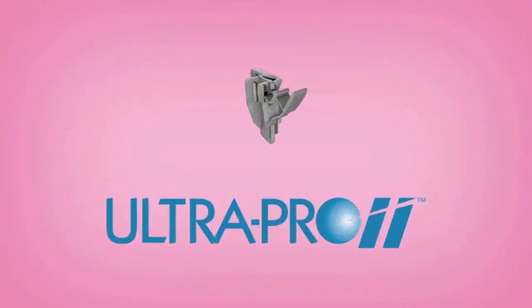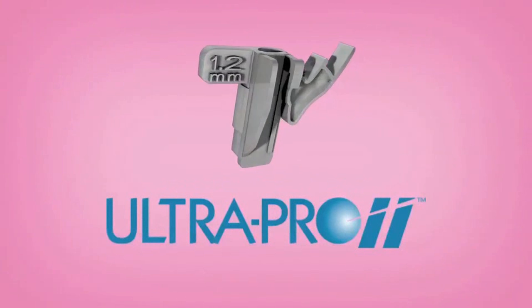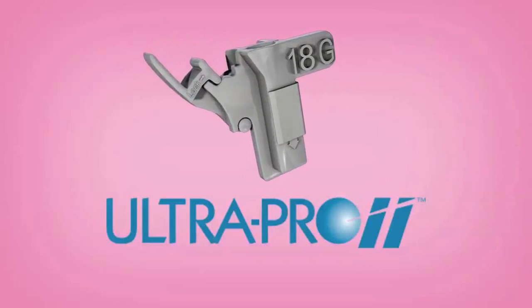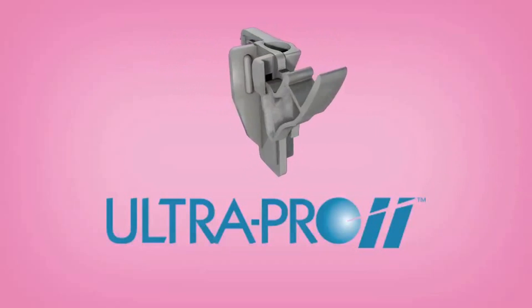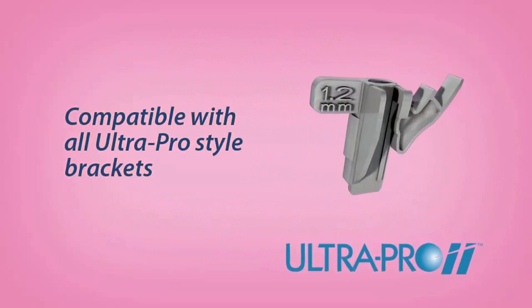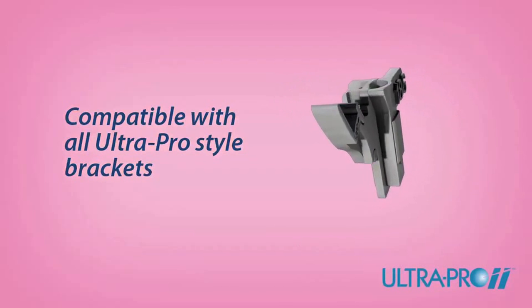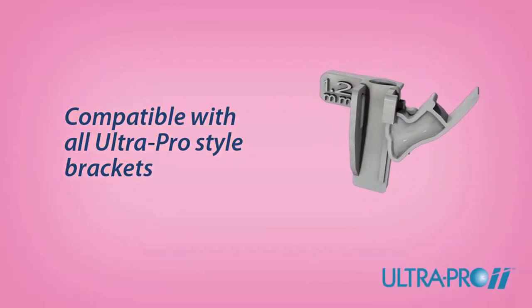Recommended for increasing productivity with ease and accuracy, the UltraPro 2 needle guide corresponds with on-screen software guidelines, ensuring accurate instrument placement within the scan plane. The UltraPro 2 needle guide is compatible with all UltraPro style brackets created custom for leading ultrasound equipment manufacturers.